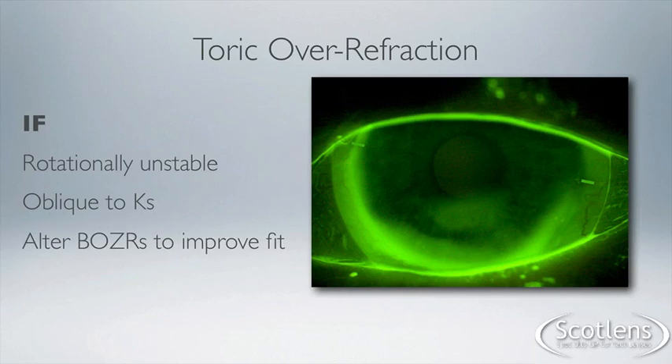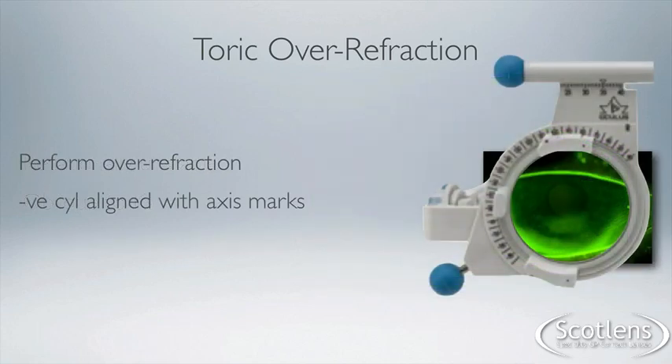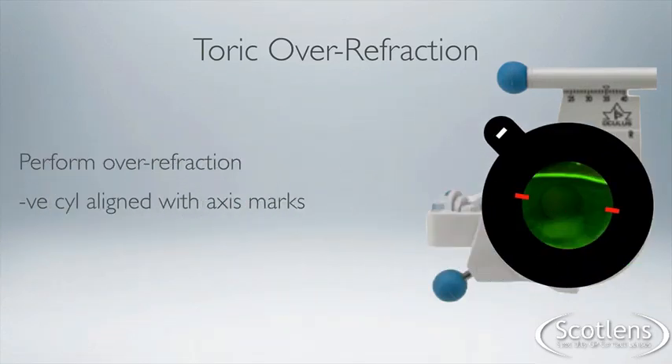If the marks are unstable or oblique, you need to alter the fitting — the BOZR — to try and improve the fit. Once we've got a suitable fit, we're then going to do the over-refraction. The key with this is to align the minus cylinder of your cross-cylinder or trial lens with the flat axis marks of the contact lens, as is shown here.